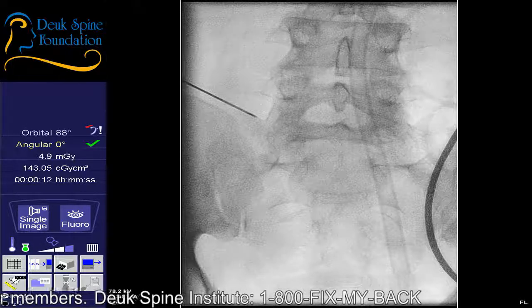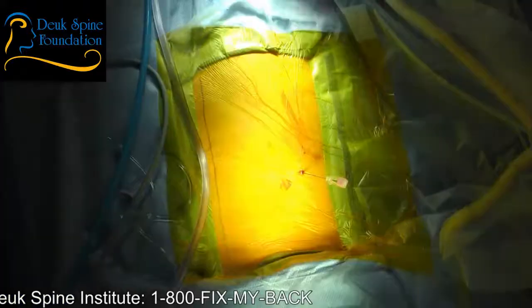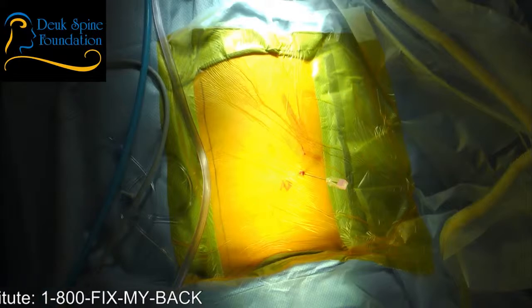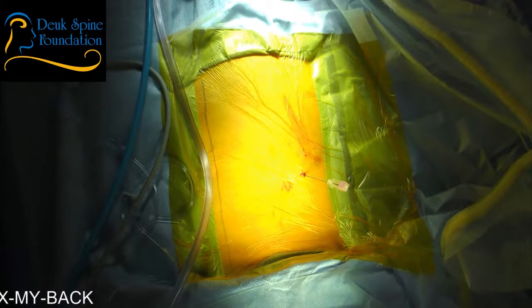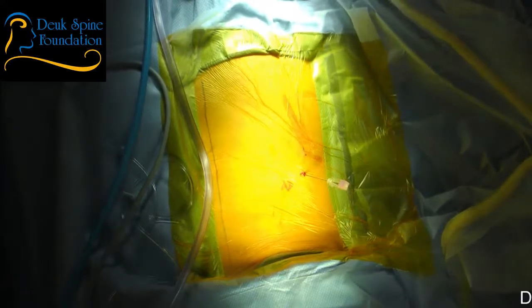Did we get that foot issue fixed for you? Yeah. All right, good. Still some pressure? All right. I need you to move up and down here till you get those facets lined up. You see them? Right where the tip of the needle is? Go up, take a shot, then go down, take a shot.